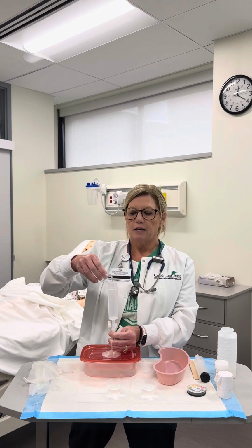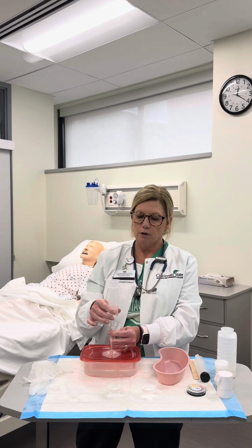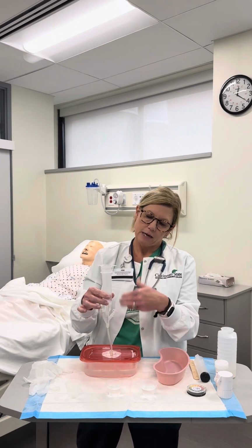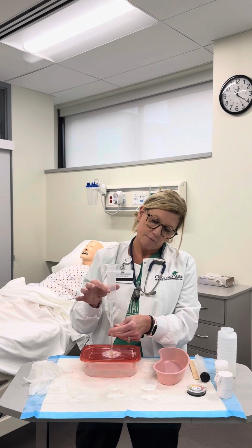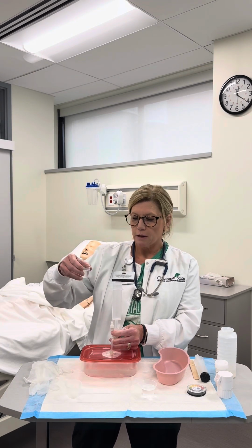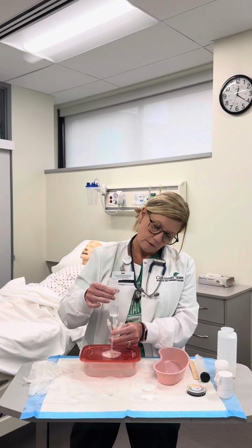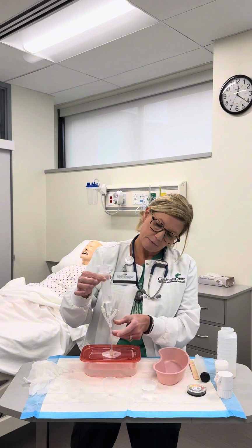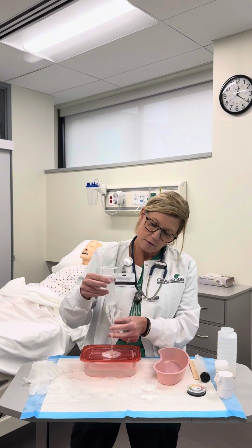Then after you give anything, you want to do a flush. So this is my flush, so that's just water. I'm going to let that go in to kind of clear out the tube. Let it go in by gravity. Next thing is my crushed med with the water. Put that in. Let that go in by gravity. Once it's down to the tube, I'm going to pinch it again.